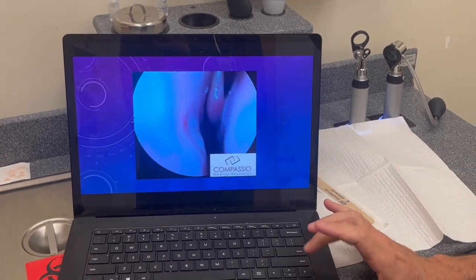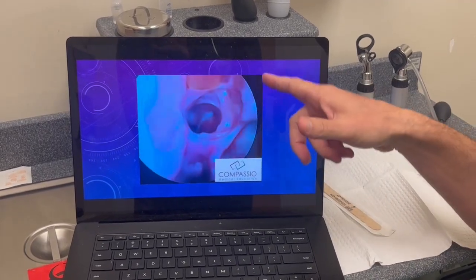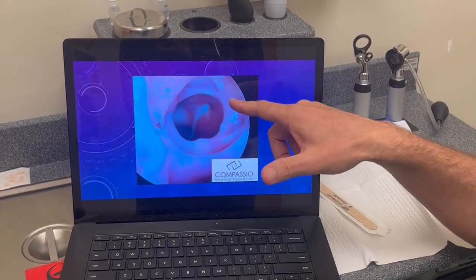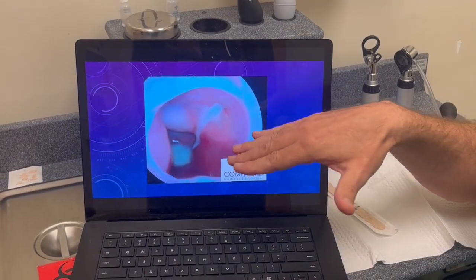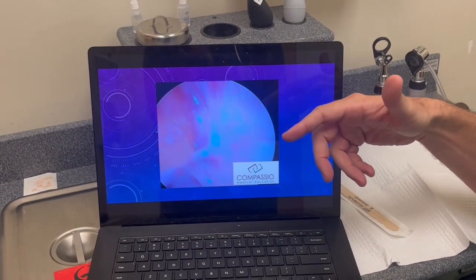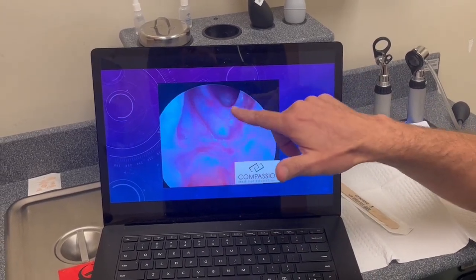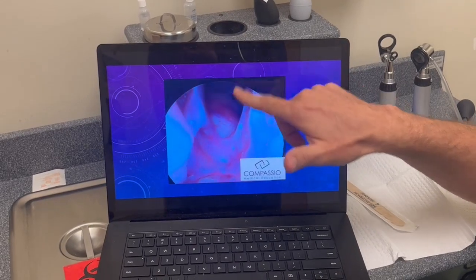Now let's take a look at my next patient — a left side. Middle turbinate right here, lamina or eye socket right here, sphenoid sinus. Now you see that this patient has a little mild infection in her left sphenoid sinus. Here's a little swelling up here, and as we come out, here's the skull base and here's the frontal sinus, which is nice and open.